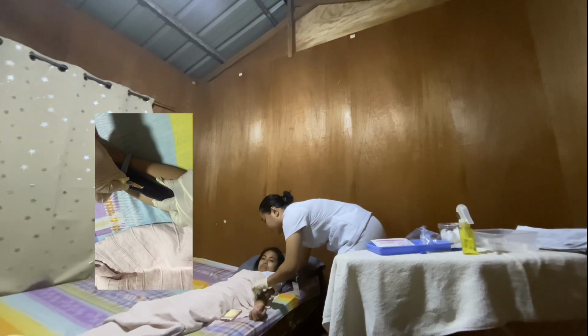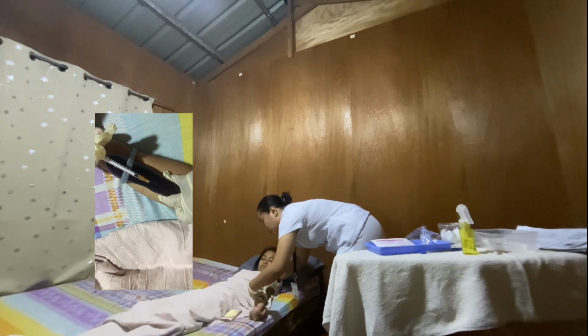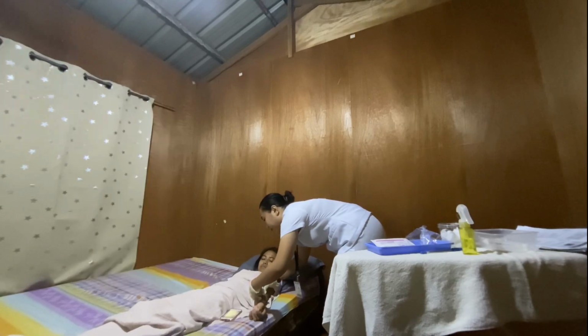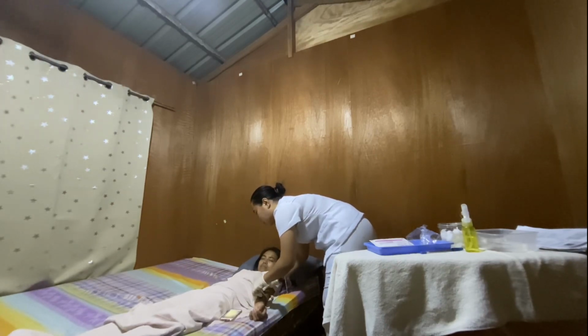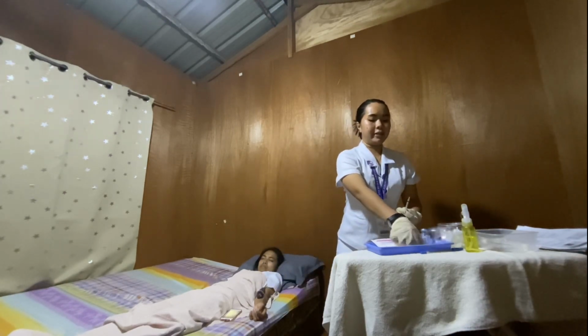Next is to stabilize the syringe and needle and inject the medication carefully so that it produces a small wheal on the skin. This verifies that the medication entered the dermis. Next is to withdraw the needle quickly, at the same angle at which it was inserted, and then cap it and discard it.